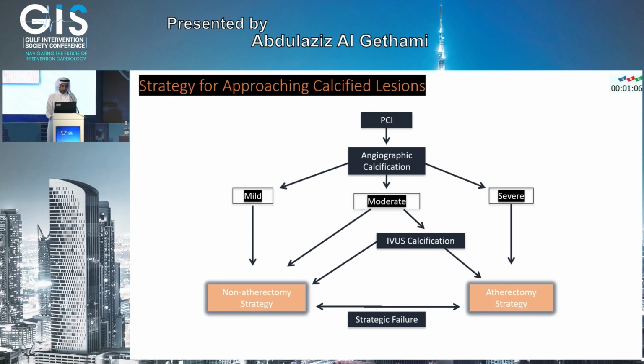So these calcified lesions have a lot of publications going on. I agree that when you do have severe calcification, it's like a road trip. Probably extra imaging might help to guide our decision regarding deep calcification, but most of the time, deep calcification is not well studied compared to superficial calcification. The superficial calcification is where the money is, where the thickness is, where the arc is.